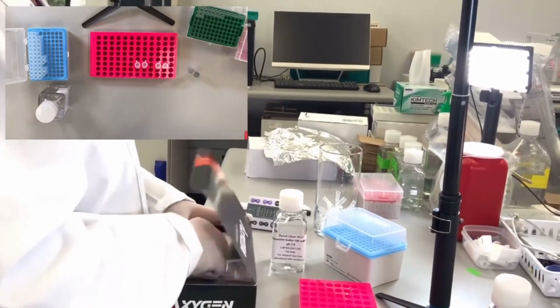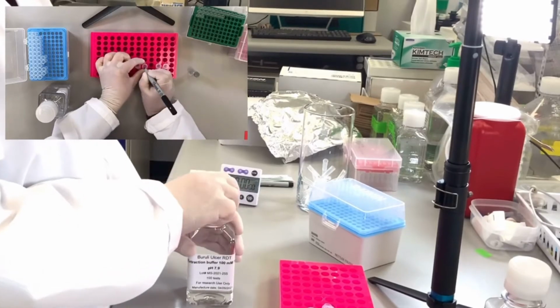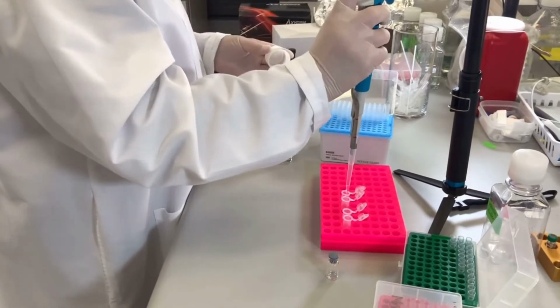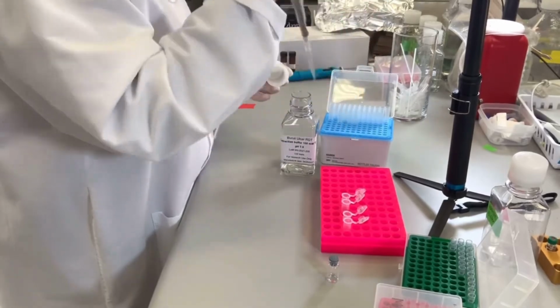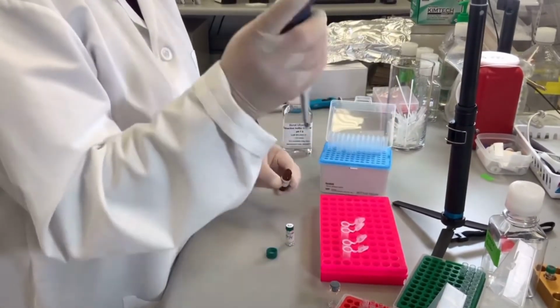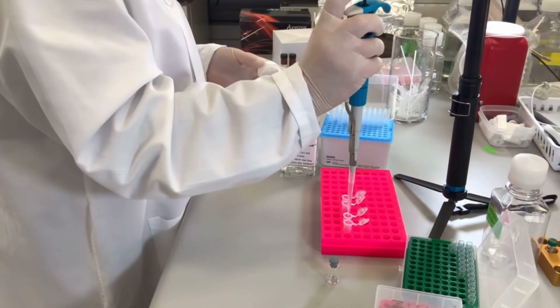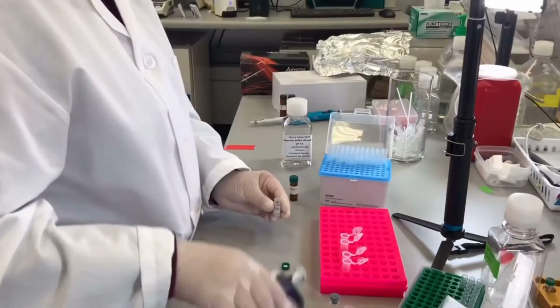Next, let us prepare the negative and positive controls. It's a good idea to run them in duplicate. To prepare the negative control, add 500 microliters of TEA extraction buffer to the vial. If you would like to ensure best results, you can add 1 to 2 microliters of absolute ethanol, but this is optional. To prepare the positive control, add 500 microliters of TEA extraction buffer to the vial.